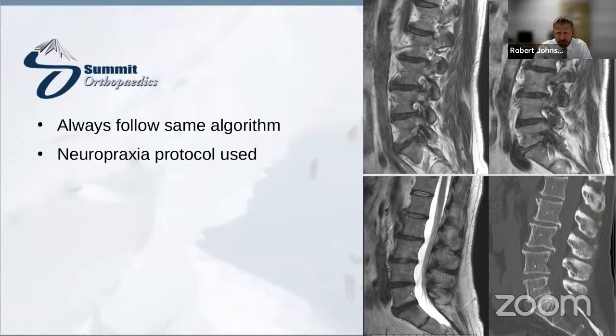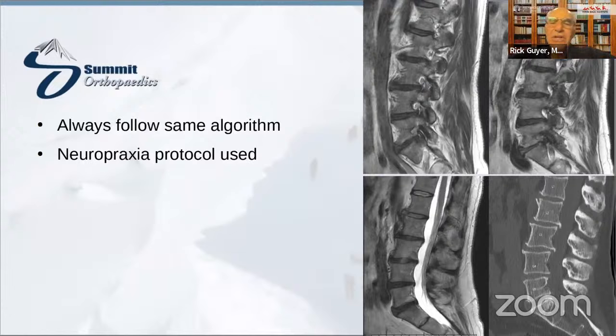And so I did that with this guy, not necessarily because he was super collapsed from top to bottom or showing tons of modic changes, but because we're doing 4 levels. And the more levels you do, obviously, the higher the height and the stretch of all the nerves we're encountering. So in his particular case, it wasn't necessarily because he was bone on bone. It was more because of how many levels we're doing, the chronic radiculopathy, and some of those other aspects in this specific patient. And Rob, how did you decide that all 4 needed to be done?